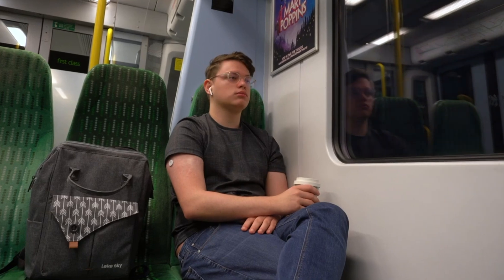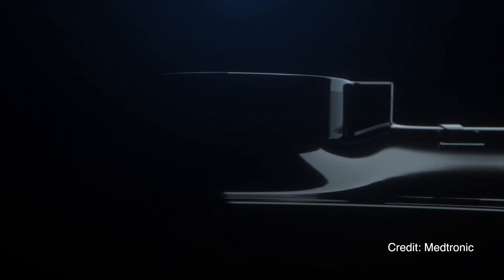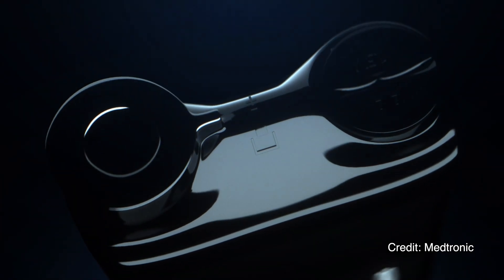Medtronic just announced a global partnership with Abbott to create a custom version of the Freestyle Libre which will work with Medtronic pumps and pens. We both never saw that one coming. In this video I will break down exactly what was announced, what I think about it, and a few important caveats that I think you should know.